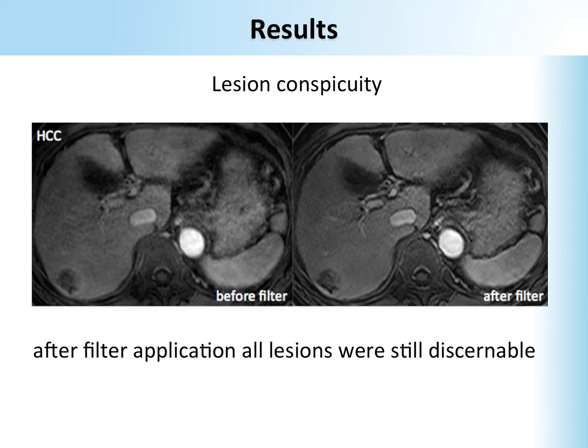And another thing which I want to show you here is that after the filter application, all reference lesions were still discernible. And if you make a side-by-side comparison of the lesion conspicuity in the original and the artifact-reduced images, we see that the lesions were more conspicuous after MARC application.